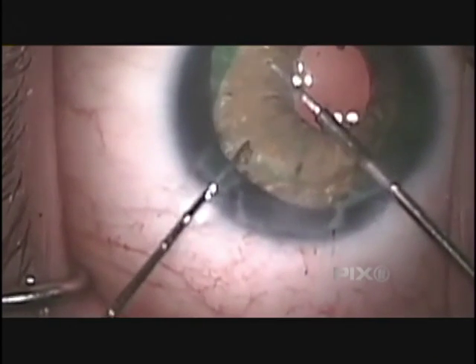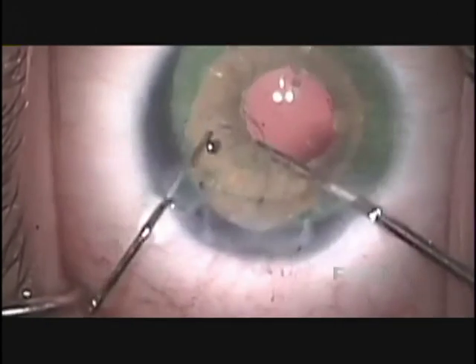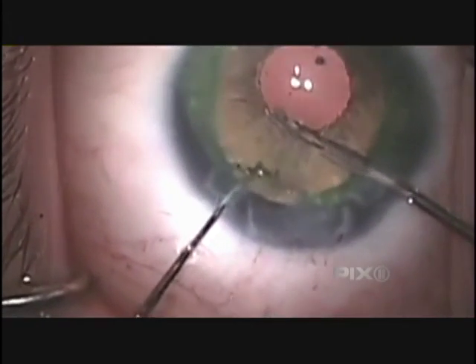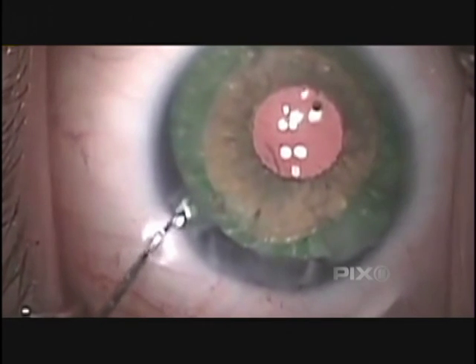So this is already opened up now. This is the implant opened up, and now what are you doing? Now what we're doing is stabilizing. When we take the cataract out, we leave the shell. We call that the capsular bag. And this is actually going into that shell to stabilize it. And then some scar tissue will form around the edge of that, and that's what will keep it in place permanently. Wow. What's so amazing to me is that it just looks so incredibly natural. Very natural, very well tolerated, and produces excellent visual results.